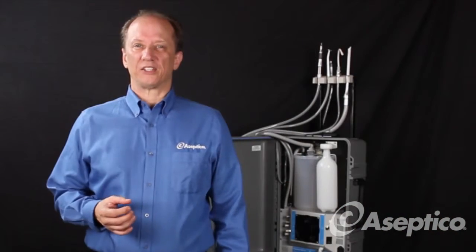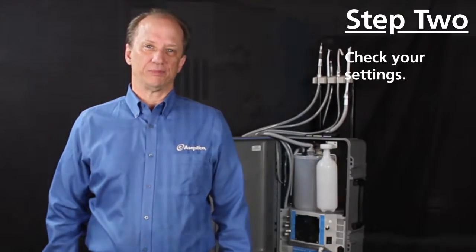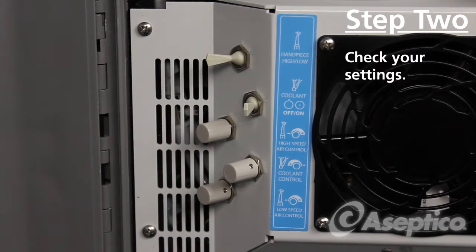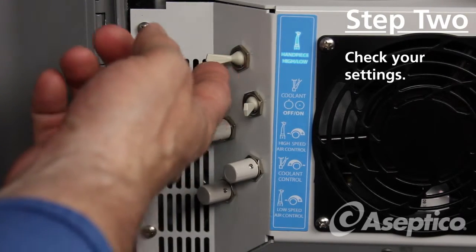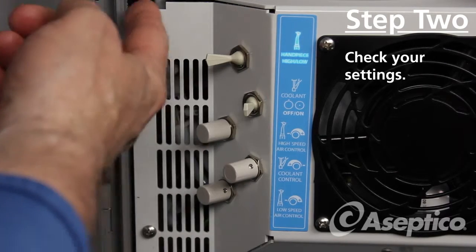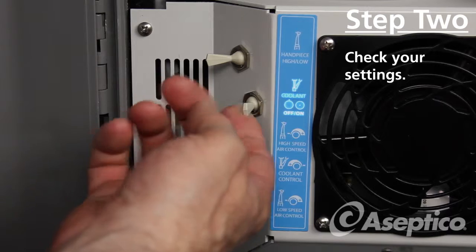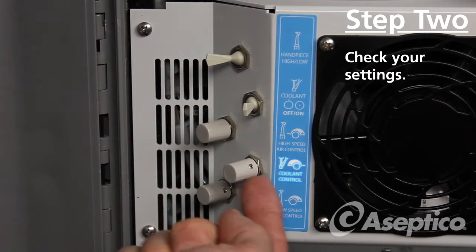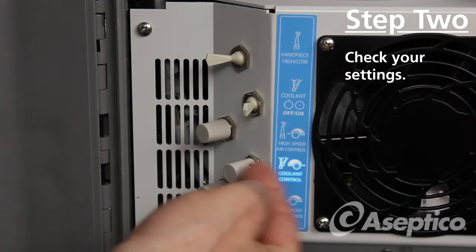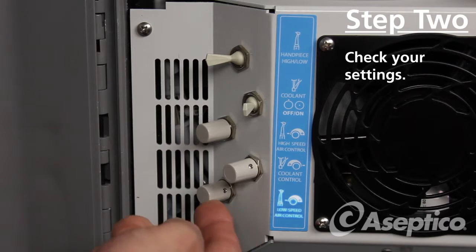The second thing you want to verify is that the controls on the Express are set properly. Let's do an overview of the switches on the unit. The top one is your high speed/low speed. The second one is to turn your coolant on and off, and this third one is the high-speed air control. This is the coolant control that adjusts how much water goes to the handpiece, and then the last one down here is the low-speed air control.